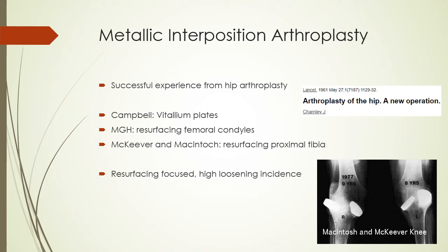However, because it's just a simple resurfacing, and we know the load conditions in the knee are so complex, these earlier trials actually had a high loosening incidence, as you can see in the X-ray 9 years later, 8 years later. These tibia plates without a fixation mechanism basically just got loose.